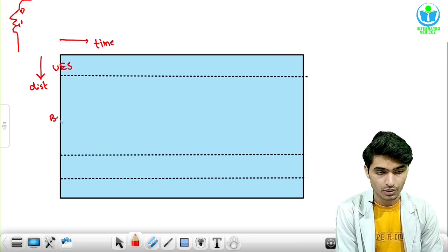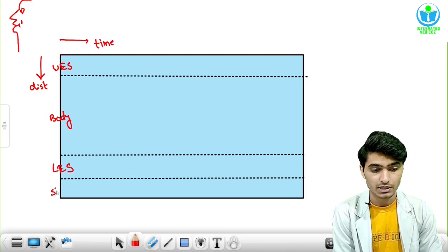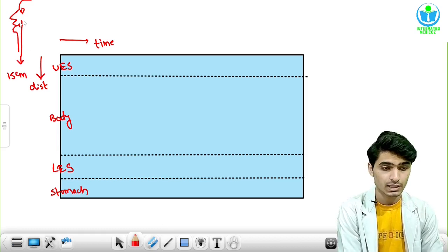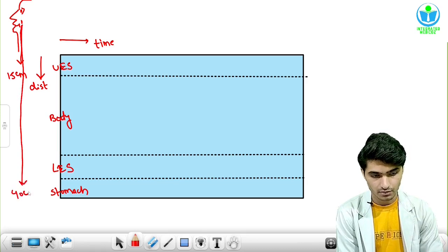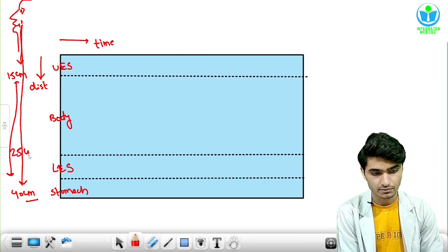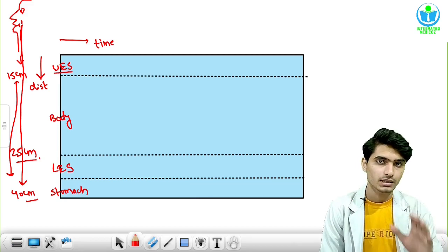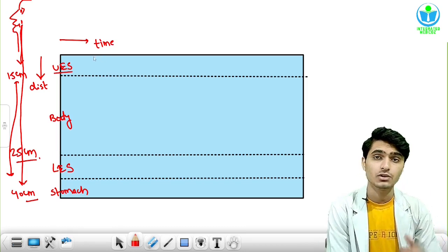This is the body of esophagus, and this is the lower esophageal sphincter, and this area is the stomach. Ideally the distance should be 15 centimeters here — the first constriction. The distance up to this area is 40 centimeters, and this 25 centimeter gap is the esophagus. This gap is from the upper esophageal sphincter to the lower esophageal sphincter. This is the whole representation of the esophagus throughout the Y-axis, and on the X-axis we are just plotting the time.